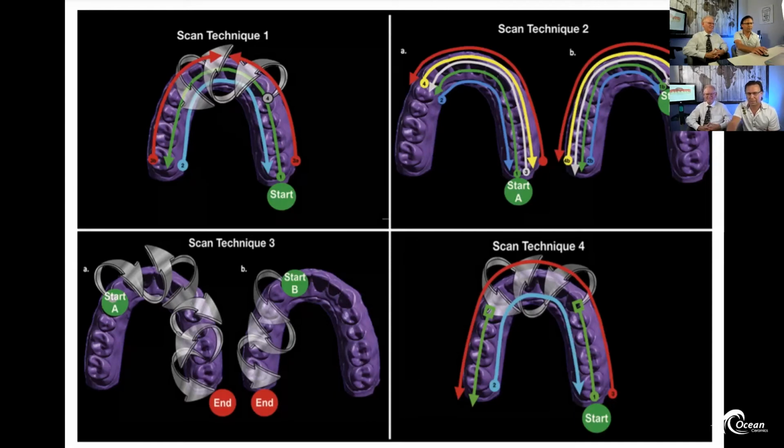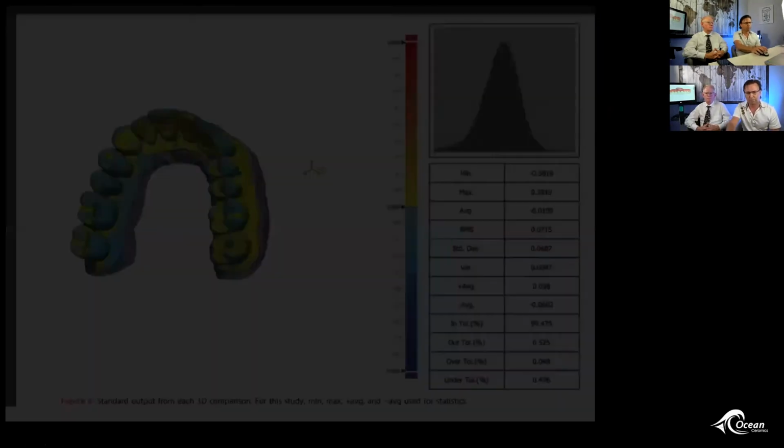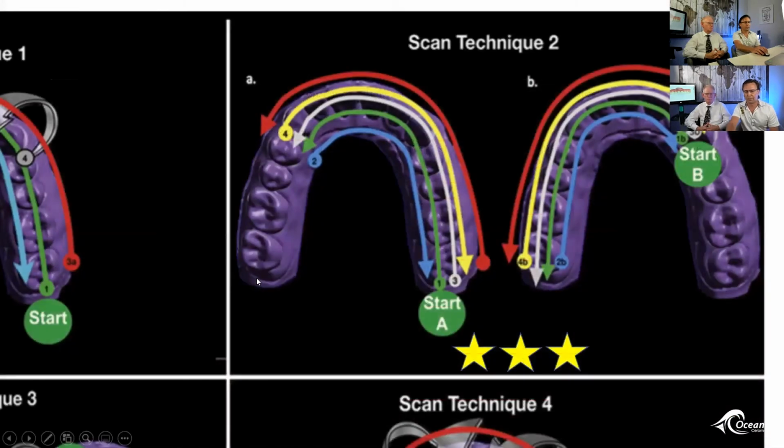Yeah, all right. Okay. So what they did is they took all these scan patterns of data with different scanners. 4 different scanners were tested, and they just layer them all together, and they're looking for all the standard deviation, the average data of what's most common. So I'm not going to read every data here, but they basically scan pattern 1, 2, 3, and 4. They got an iTero Element, an Emerald, Omnicam, and a Trios. Scan pattern number 2 is the winner, and it just makes sense.